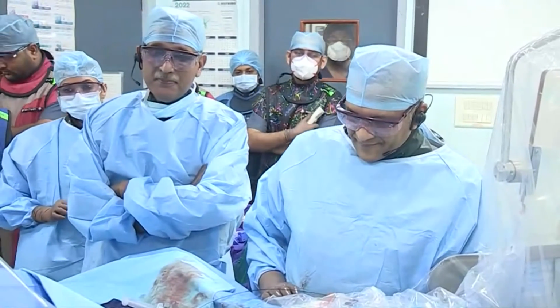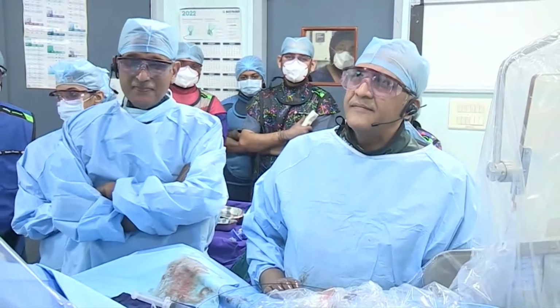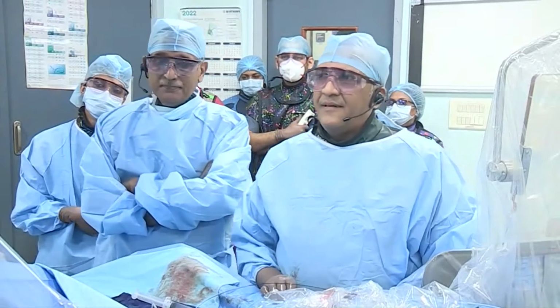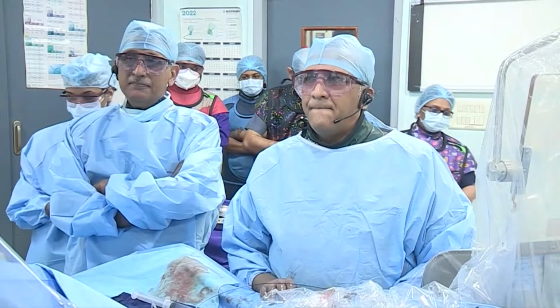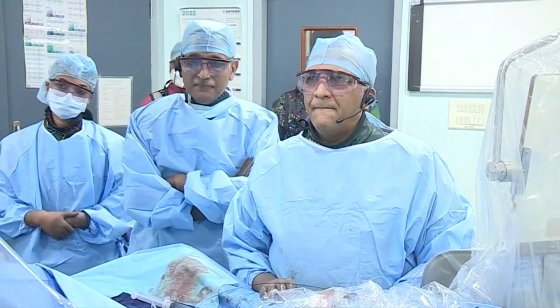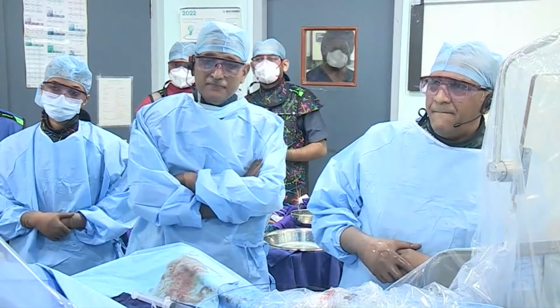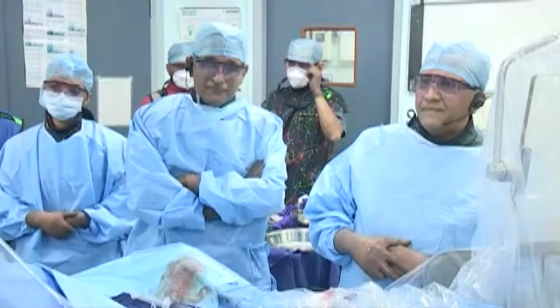A really also very interesting case. Probably you don't have an orbital atherectomy system available in India. No, we don't have. Okay, so I have done more than 100 such cases in the last year. So in my cath lab, practically the first choice to try to ablate this calcified lesion would be orbital atherectomy to make a channel. And then the next step will probably be a combination with an OPN balloon or probably a shockwave balloon.